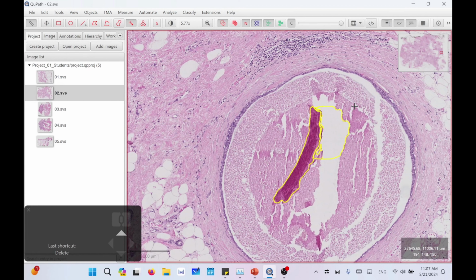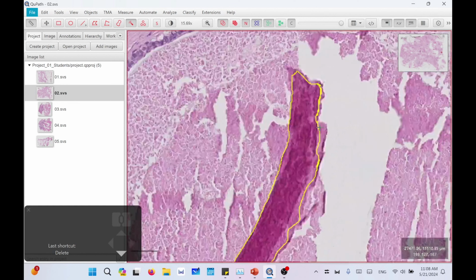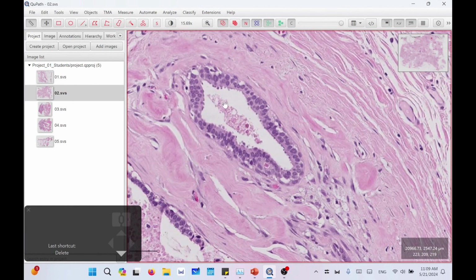You can simply press the Alt key, and inside that region you continue annotation. The Alt key will start to deselect the region you are highlighting. So it will deselect and minimize that selection as you see here. And after you finish, if you need to include another part, you release the Alt key and start annotation from inside to outside.